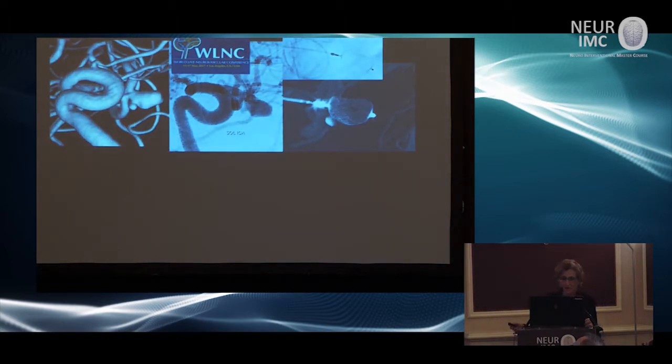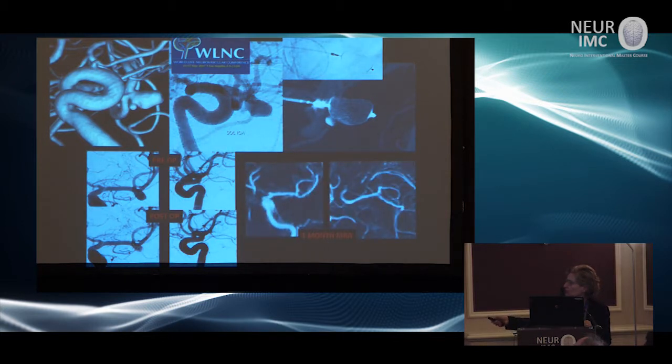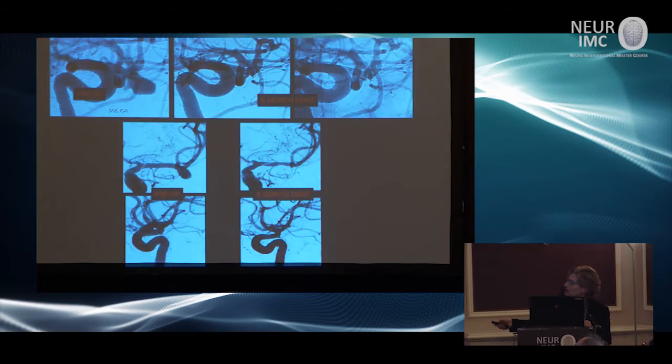This one I treated during the WLNC 2017 in LA. With one device, the contrast stagnated in the nipple. These are post-operative. And then 1 month MR angiography. And these are the 6-month control, complete occlusion.